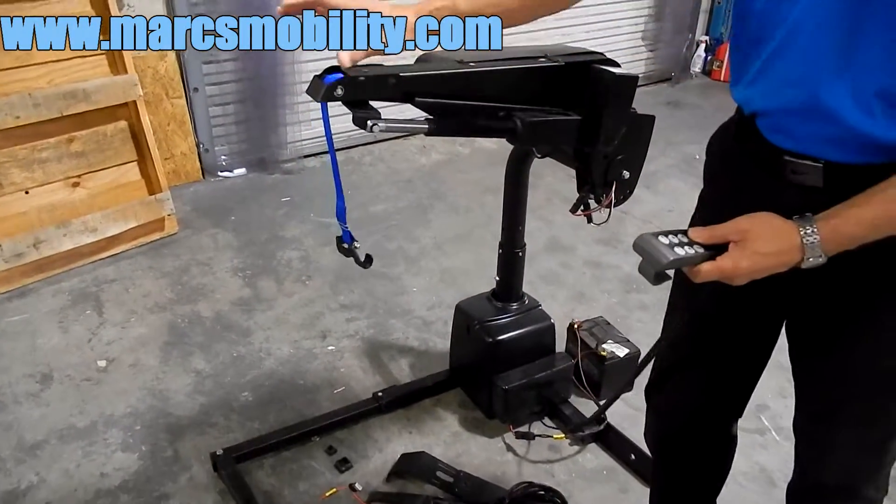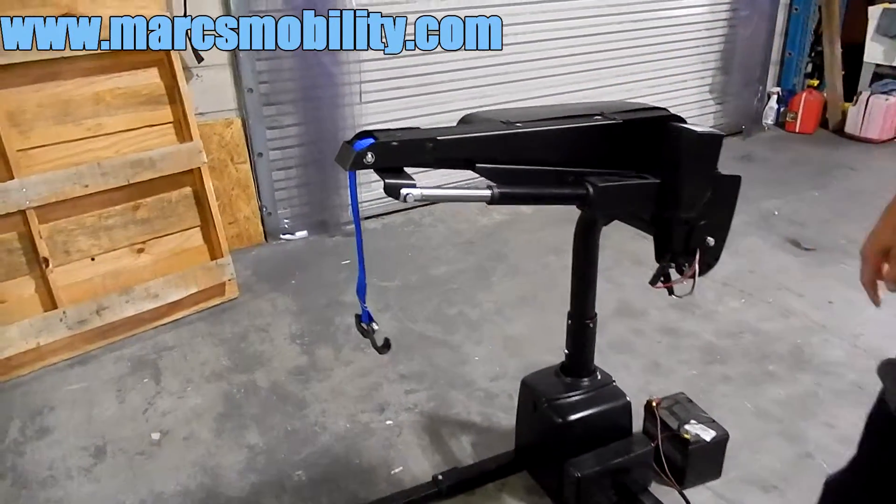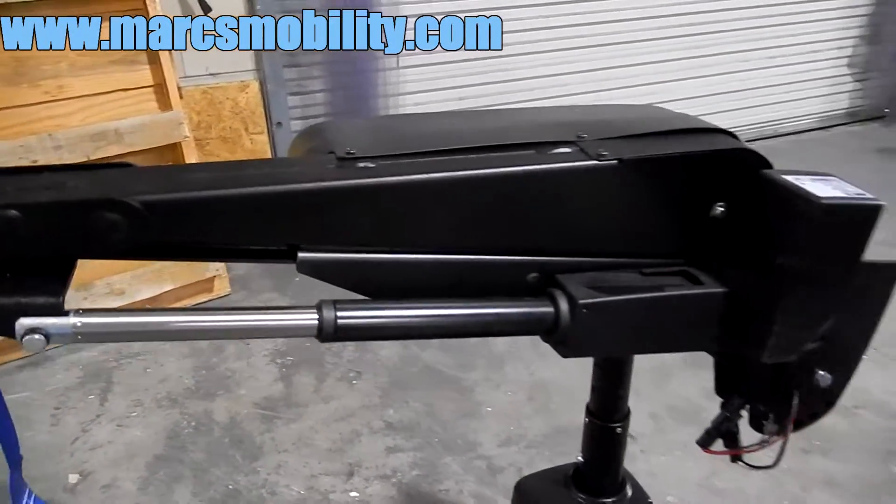Also, if you need more extension out, there's an extended boom. You can see it going out right now. This will extend out very, very quietly — you don't even hear the motor. This would be your extension boom.